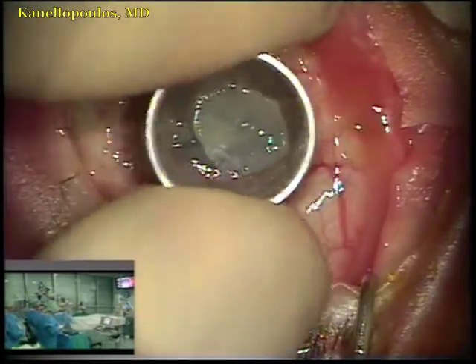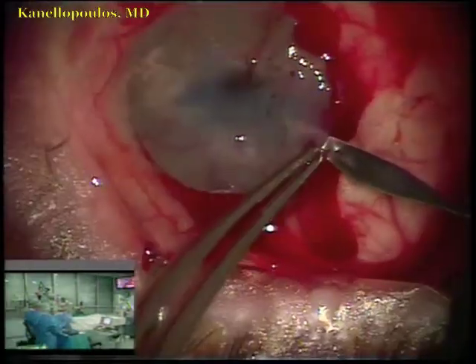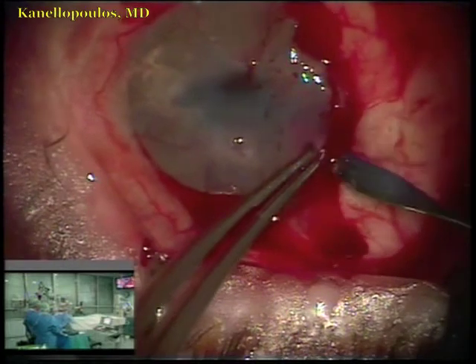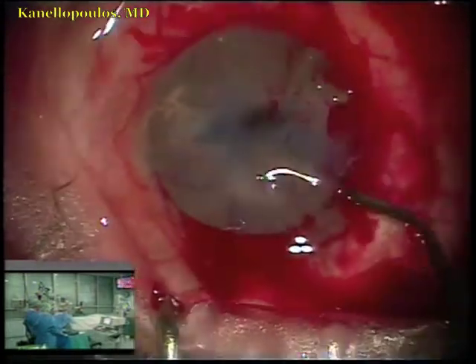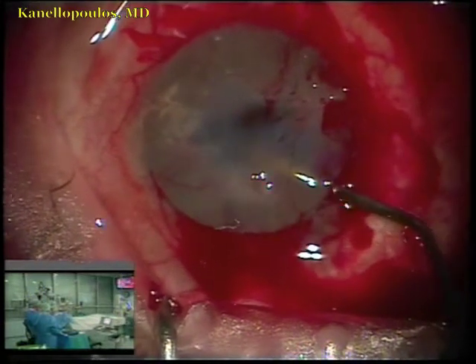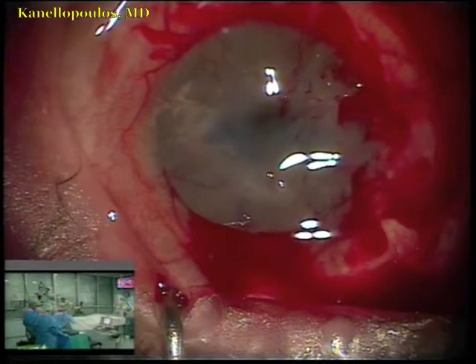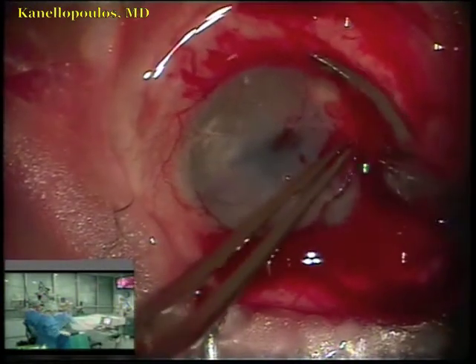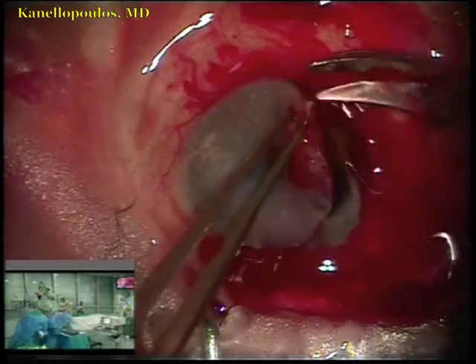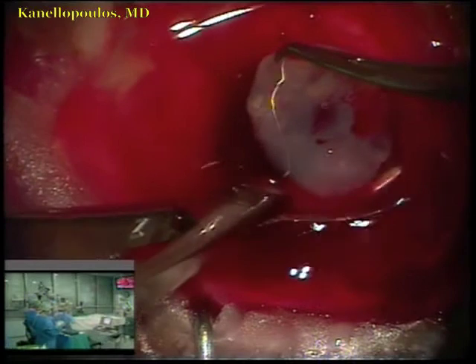Now freehand trephination with a 9-millimeter trephine on the patient's cornea. Peribulbar block, entering here with a cornea incision. The neovascularization of the host cornea is making the field quite bloody. We'll fill with methylcellulose, and then using the curved cornea scissors, complete the host diseased cornea trephination.